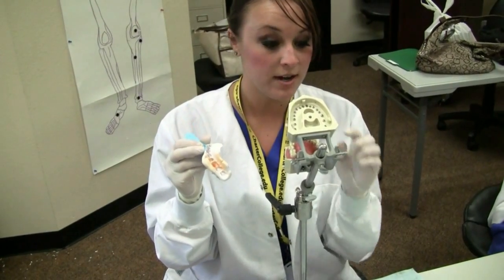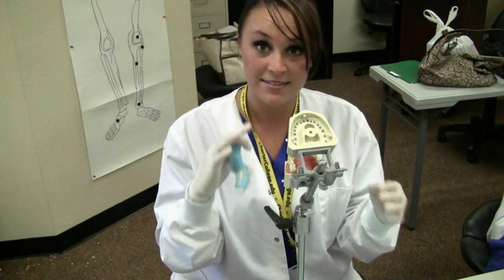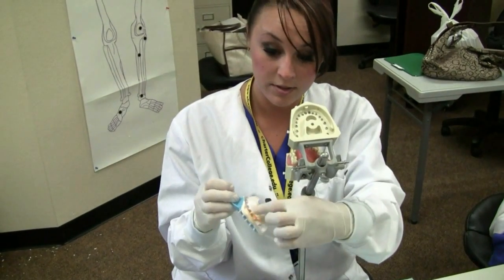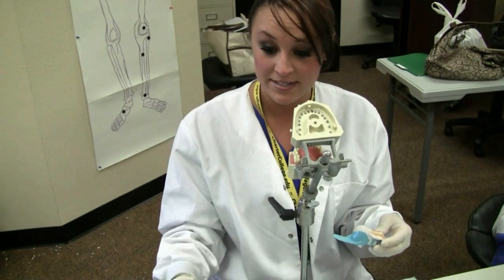This is the final impression after you've let it sit for about five minutes. On these it takes a little bit longer because the heat is not there like it would be in a person's mouth. You send this to the lab and they'll see that the orange part is the tooth that they need to make the crown for, and then they will send it back in about ten business days.